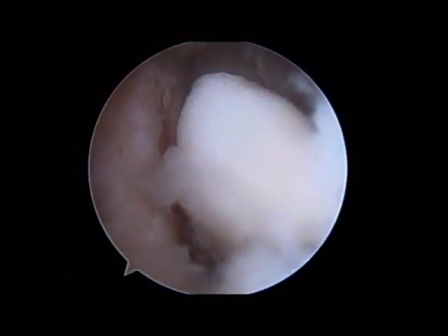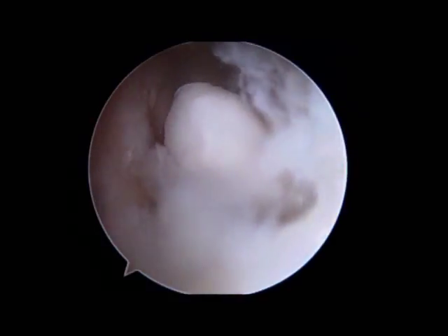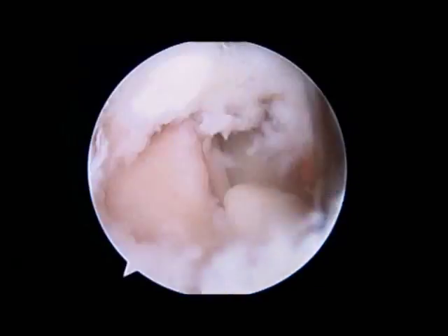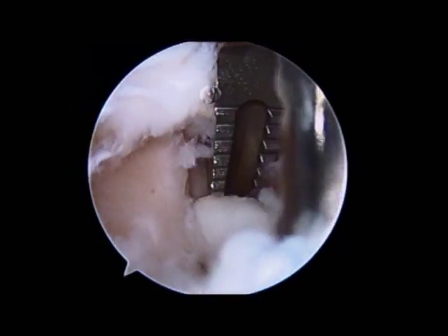Arthroscopy is performed at this point because at this advanced stage of disease it's very unlikely that conservative measures will fix this problem. You can see the loose body being removed by this metallic instrument — a grasper.